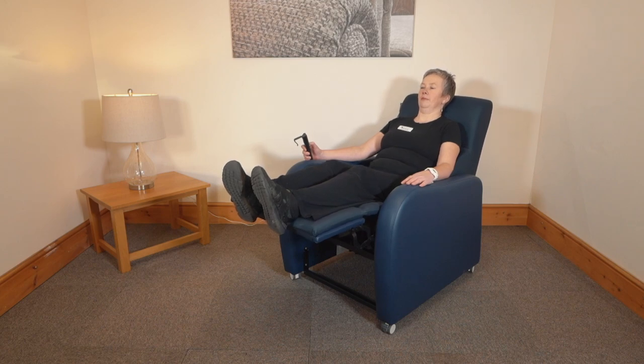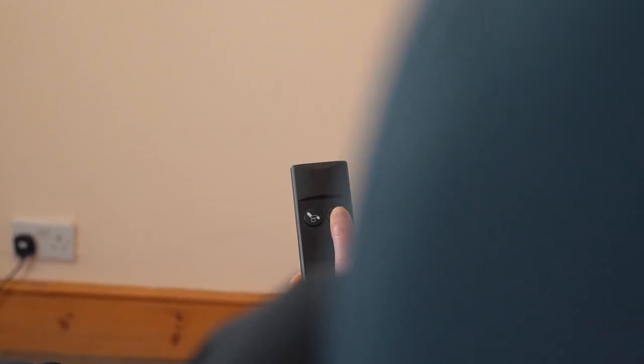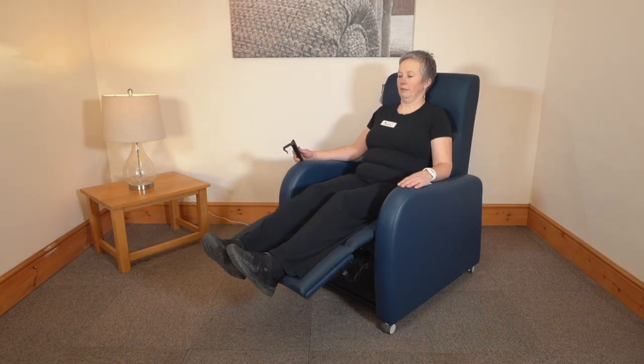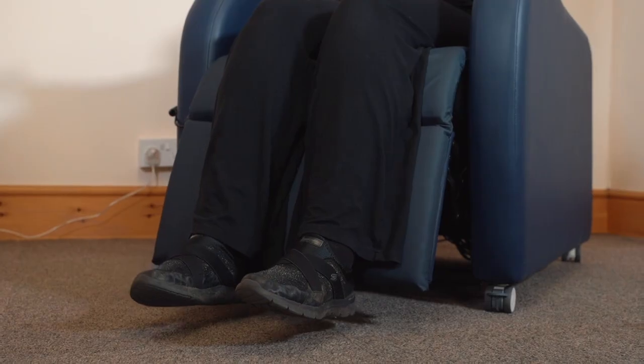The chair comes with a contoured back design for everyday comfort and there is a choice of three pressure management seat cushions. Couple this to the four heavy-duty casters for ease of movement. A full range of optional headrests and armrest covers makes this a highly adaptive chair.